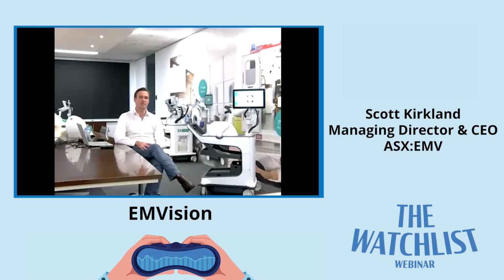At the moment, in stage 2 of our study, we are enrolling 150 suspected strokes. These are patients presenting to the emergency department with stroke-like symptoms, and they will be assessed. If suitable, they'll be enrolled. They get the standard of care, so a CT, for example, and then we get a scan immediately afterwards, not slowing down the process of intervention and treatment. And if there are follow-up scans, day 2, day 5, etc., follow-up CT, follow-up MR, we'll also get a scan then. Of the 150 suspected strokes, some patients will end up being mimics, so patients that come in with migraines, epilepsy, in rare cases brain tumours, and approximately half may be confirmed ischemic or hemorrhagic stroke.